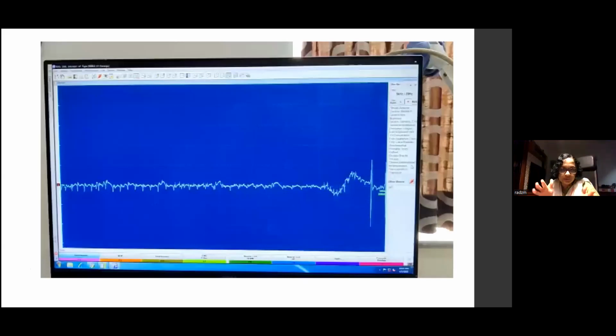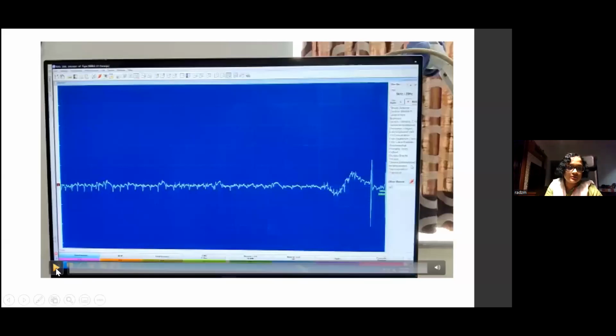When you are in doubt and you're wondering, could this be a myotonia or a myokymia, you need to compress the screen so that you can get larger amounts of the discharge on the screen. So from 10 milliseconds per division, you can make it maybe 0.1 second per division or 50 milliseconds per division, just so you can compress the discharges so that you can see the waxing and waning quality. So I'll show you here.